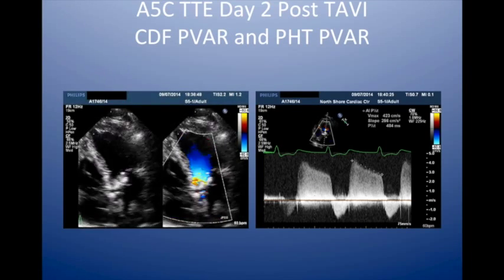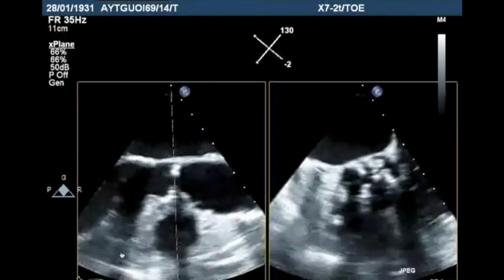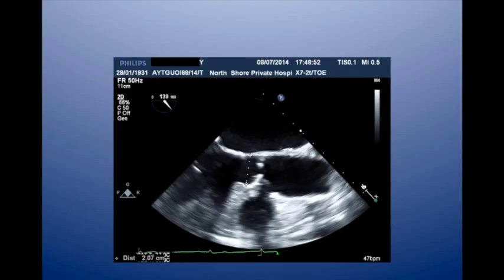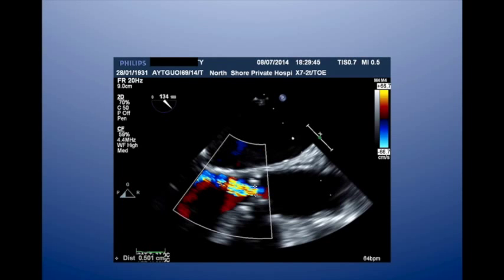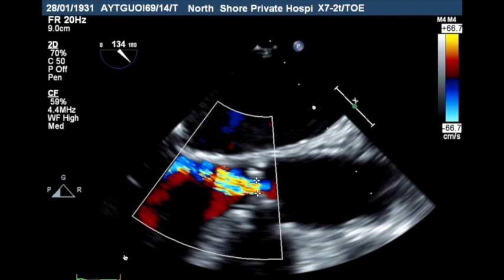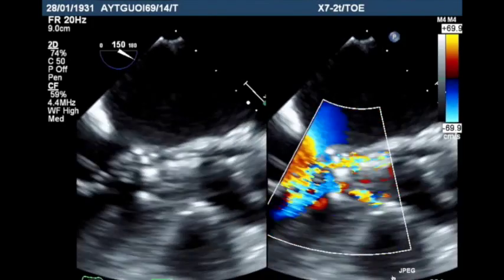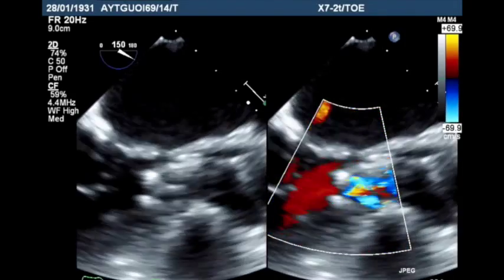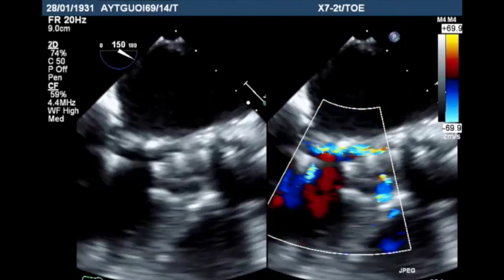Let me show you one more case and then we can take some questions. This is the TOE done on the day — the baseline. You can see there's very severe aortic stenosis with heavy calcification of all leaflets. We get a very good view of the LVOT at 2.1 cm. There was central aortic regurgitation with a vena contracta of 0.5 cm — moderate. After putting the prosthesis in, the paravalvular leak looks a little more significant than just mild: there's one jet at the top and one down here. Bear in mind that the next day when you look at the paravalvular leak in the parasternal long axis view, it will be flipped upside down because you're looking from the front instead of the back.